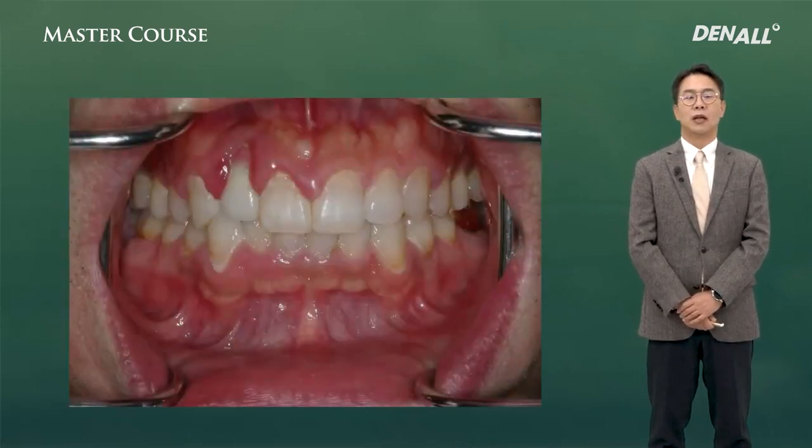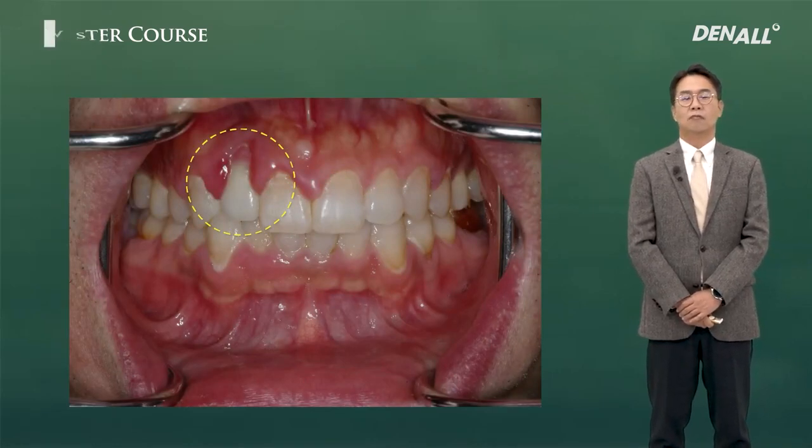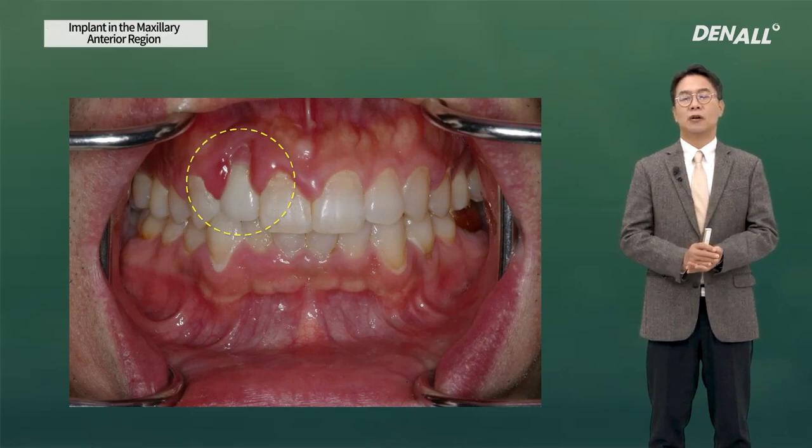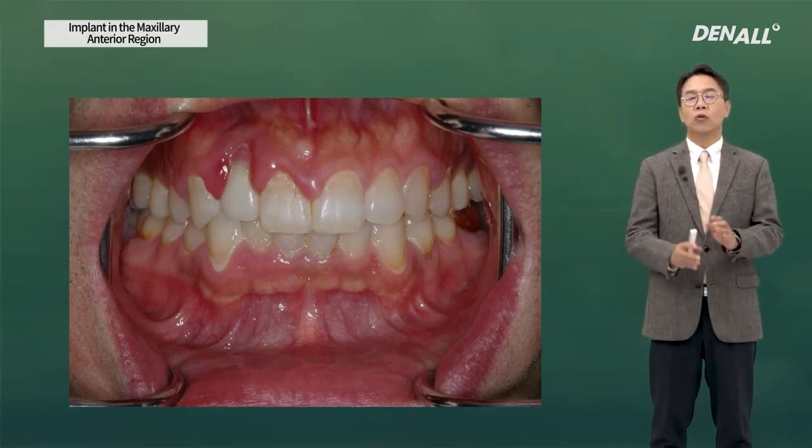Let's look at this case. At number 12, an implant was placed. Do you think the doctor who placed the implant intentionally made it that way? I don't think so. What was the problem?